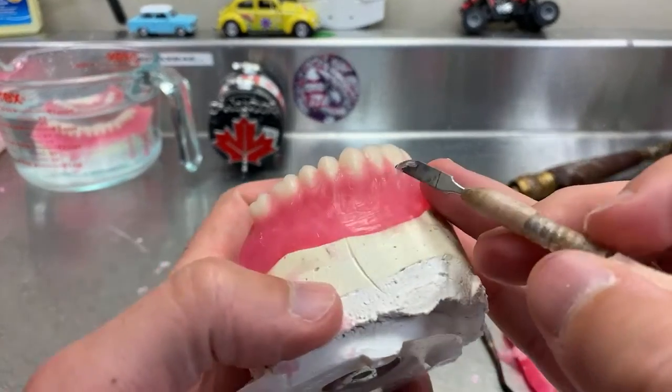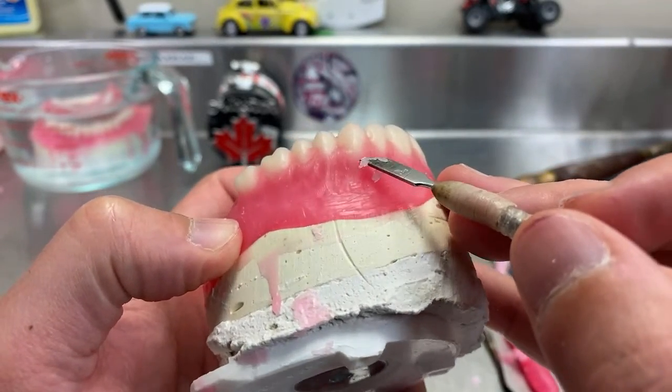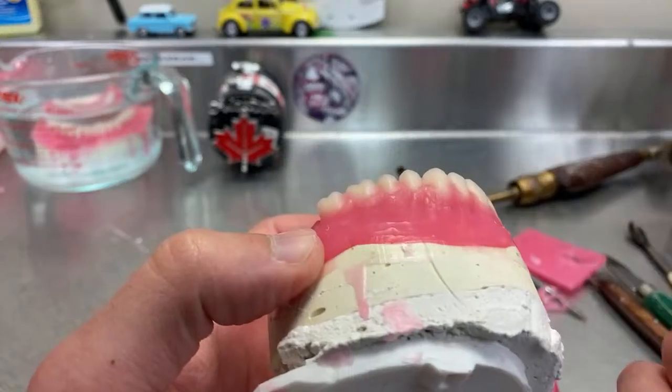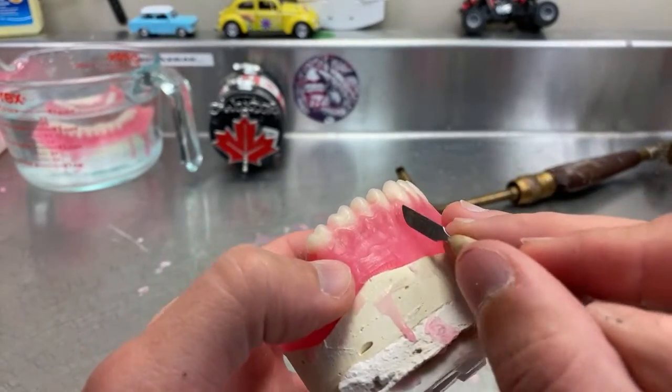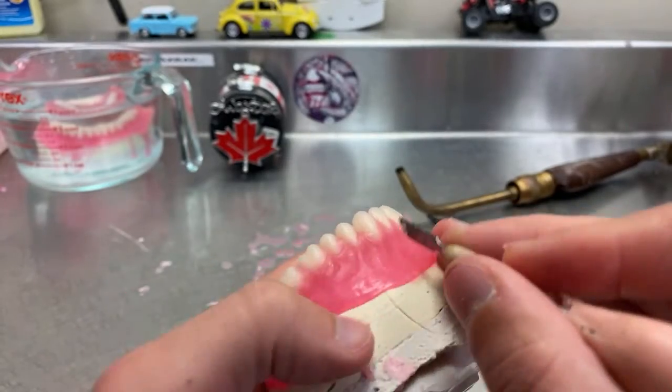I may actually add wax here. Look at that. I don't know if you can see it, but I can see the end of the tooth here, which is a problem when I start carving. We'll see how it looks after I carve. If it's bad, I'll have to add.